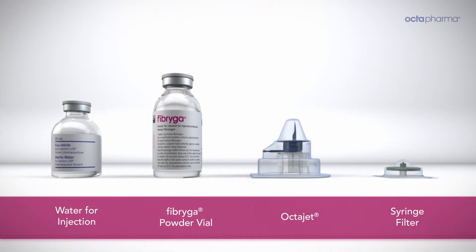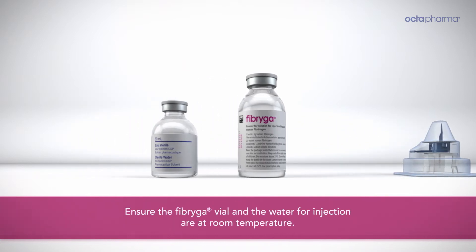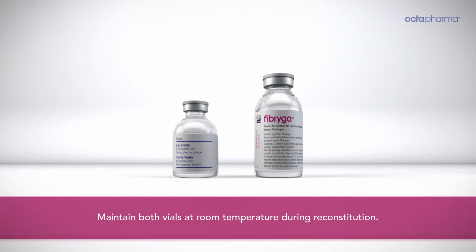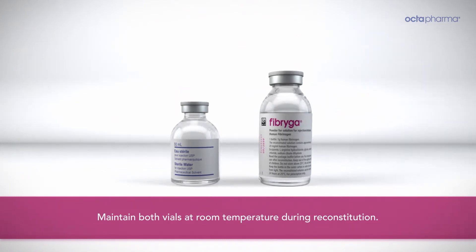Lay out the Fibriga kit contents on a clean, flat surface. Ensure the Fibriga vial and the water for injection are at room temperature. Maintain both vials at room temperature during reconstitution.